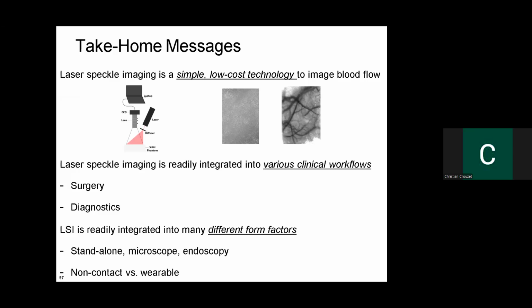So the biggest thing is most likely the software. The actual off-the-shelf components are fairly straightforward, but it's the software that they spend time and effort trying to get right. They try and calibrate their data, which we do as well. It's all the R&D that goes into creating that device. We can make the same thing in the lab for under 5K and be a pretty good device, but with having a commercial product, getting approvals for all that, it also is a financial burden.